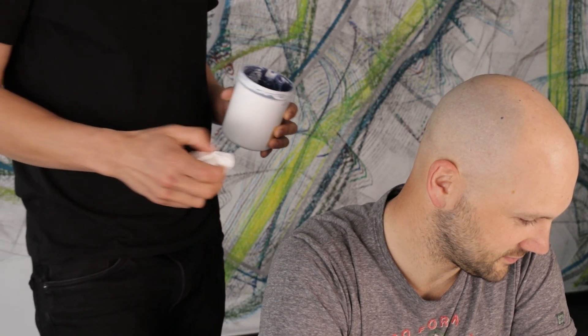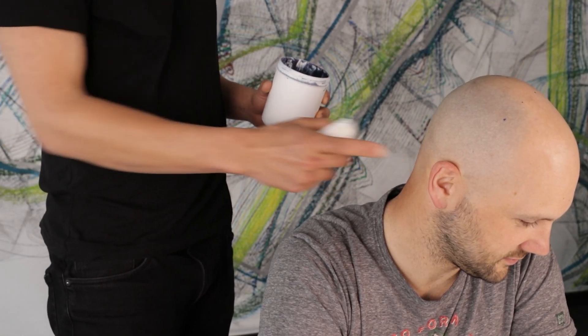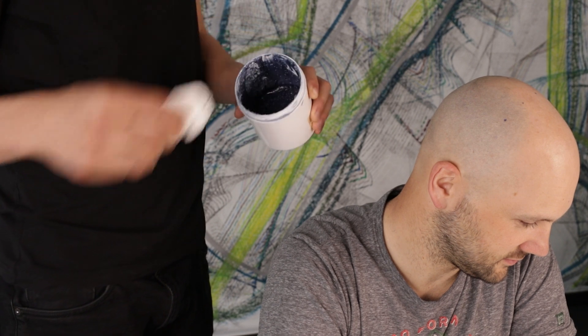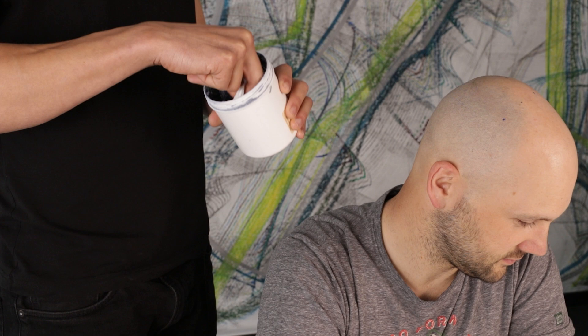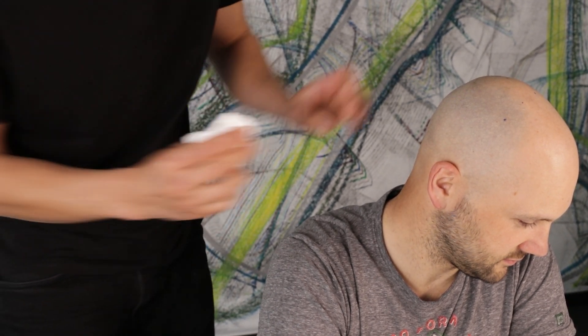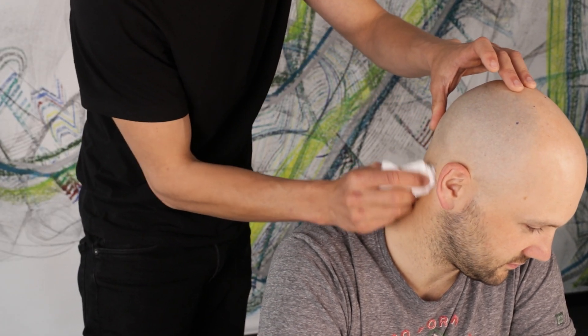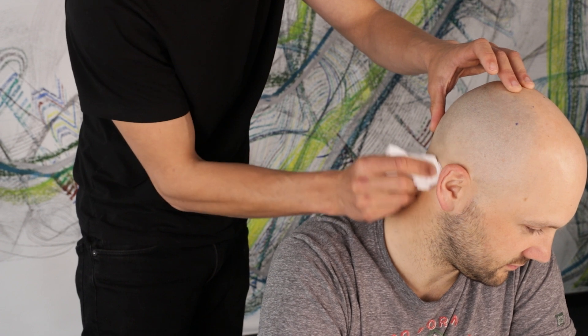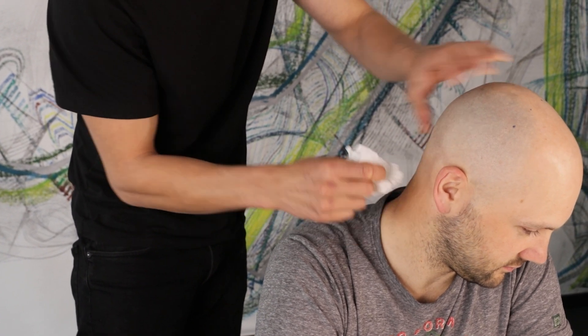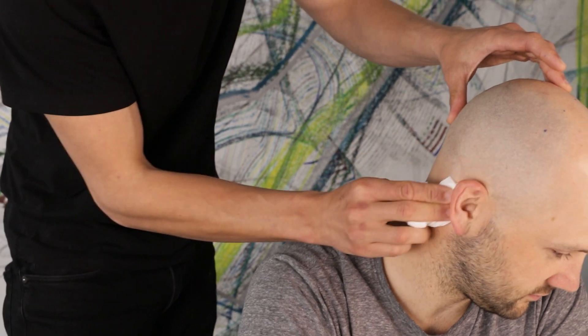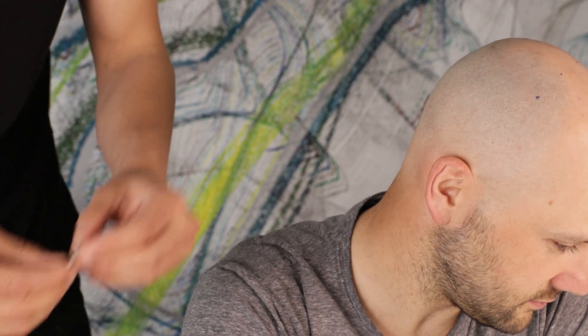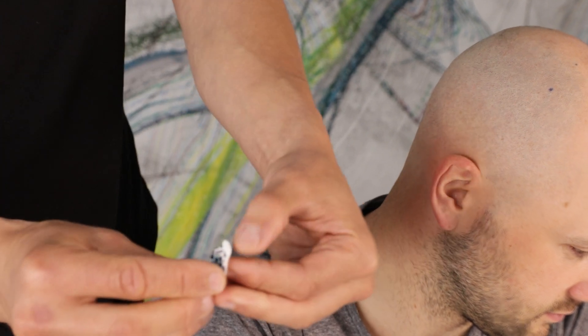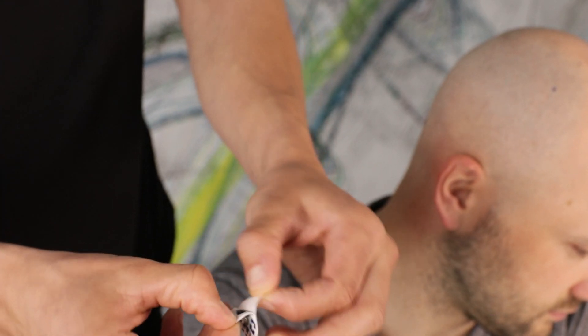As ground position we use the mastoid. For preparing the skin we can use abrasive gel and rub a bit on the skin to have better impedance. Just use a bit of abrasive and rub it on the skin. Afterwards you can use this sticking electrode clips and place it on the mastoid.